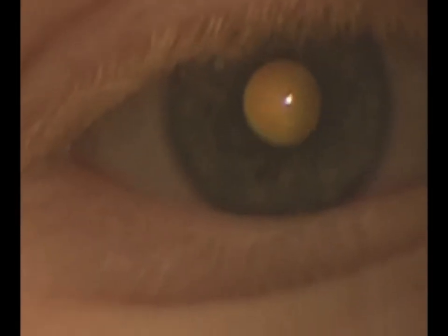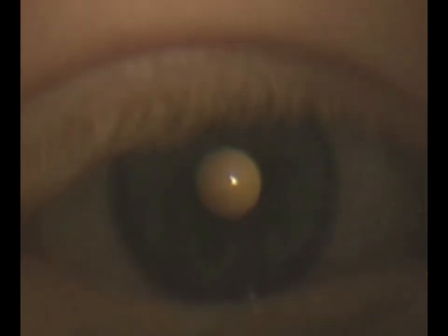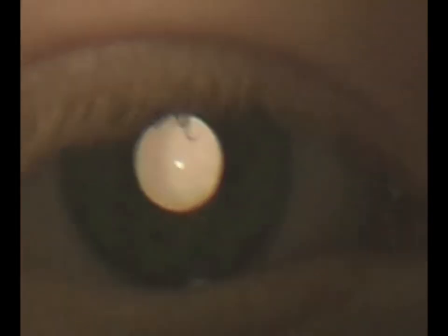Get a couple cycles here, this is really hard. We've got to set it up on a table, and it's back at the plane to the retinoscope. Now look at the target, sweetheart. There we go. We'll talk about difference in attention. Good deal.